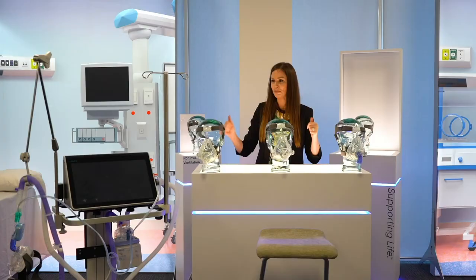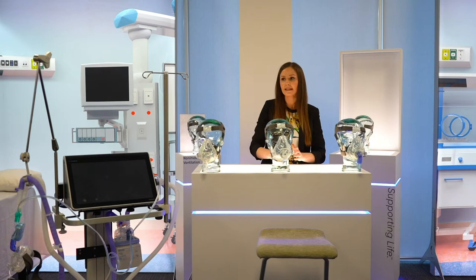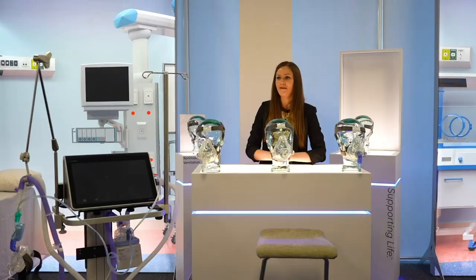So, before I go into it, does anybody know what NIV stands for? Excellent. Non-invasive ventilation. I told you it was going to be interactive. Non-invasive ventilation. So what does that actually mean? I'll explain it for you. It's really in the name, non-invasive.